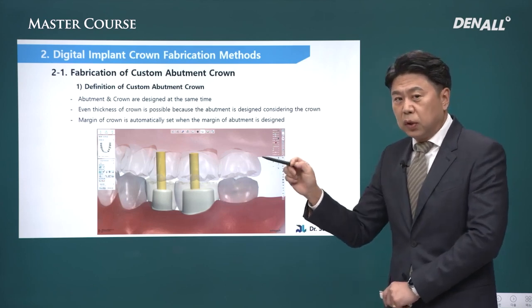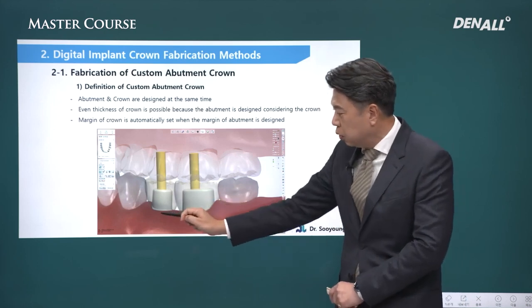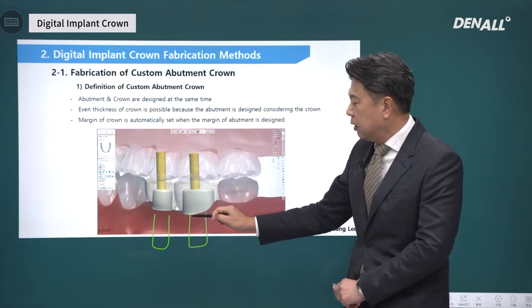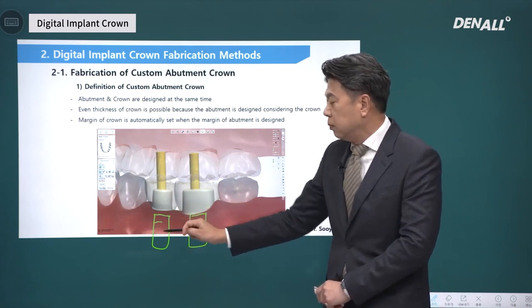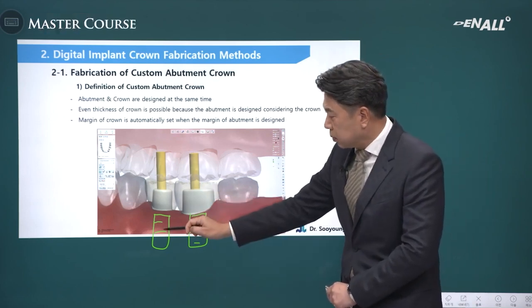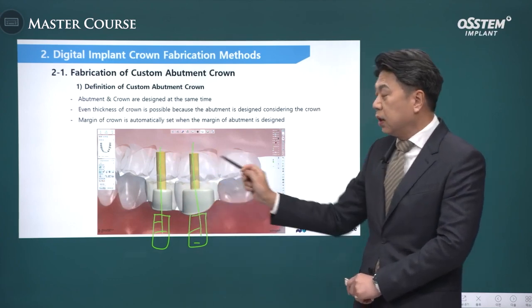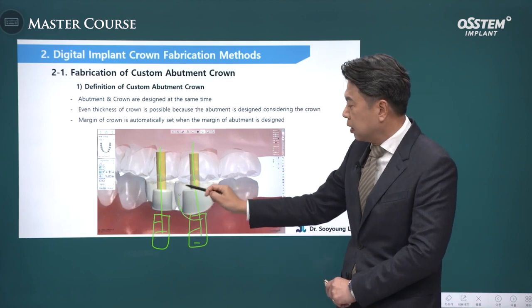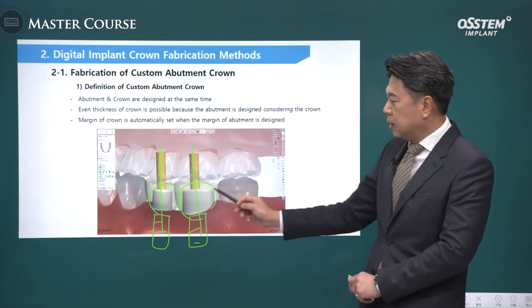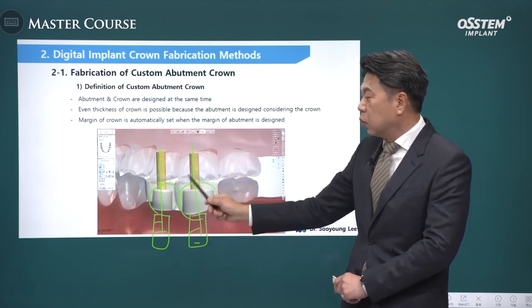The digital data from the scan body, they are not visible here, but there are virtual implants here. The data of accurate positions, depth, and angulations are already set here. Automatically, the axes are determined, so the abutments can be freely designed appropriately, considering the path of the adjacent tooth and the path of the invisible implants placed, or the relationship with the opposing teeth.